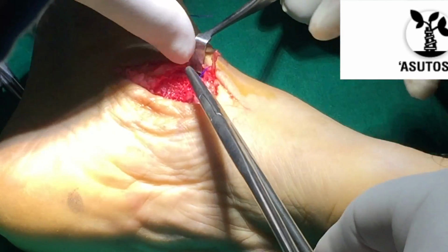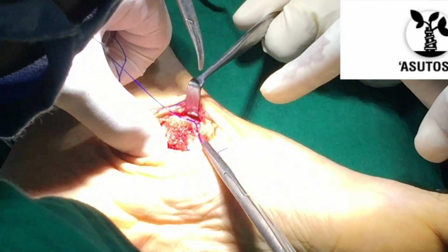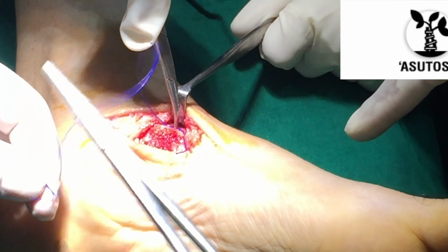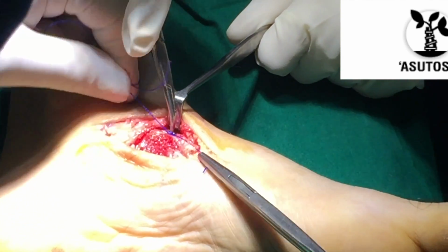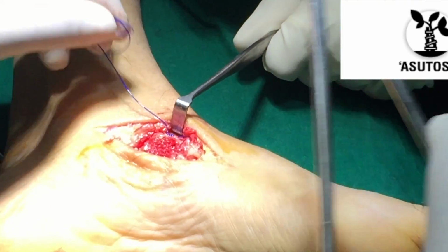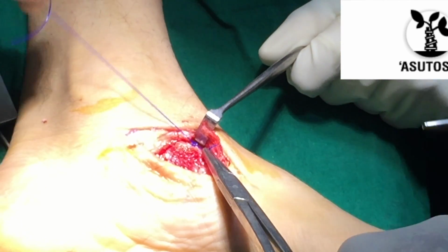So basically, depending on the preference of the surgeon, he needs to decide how many knots have to be applied. We have decided to knot it 5 times.